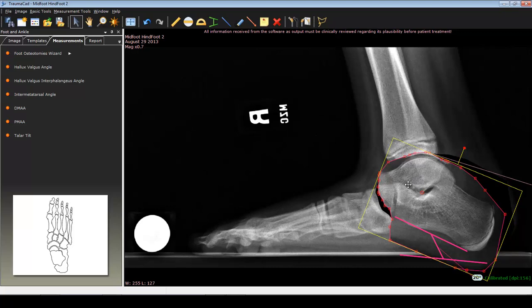And so what does that mean though? How does this help me from a soft tissue correction standpoint? Well, once I put the talus right where I want it, I go up here and I grab my ruler and I use this gap that's been created to measure how much lengthening of the Achilles is really going to occur from the calcaneus.